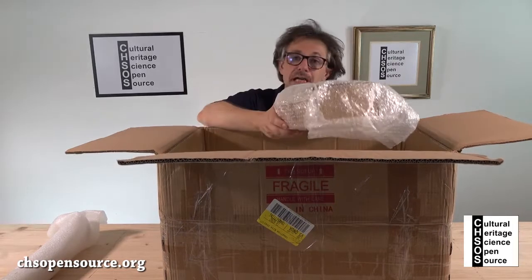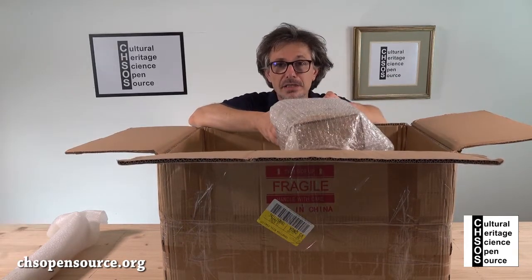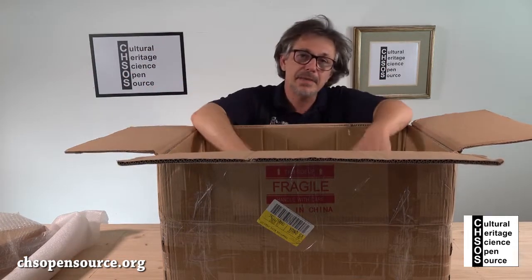This is the tripod adapter, for when you want to mount the Elvira spectrometer over a tripod. And the last piece on the bottom is the actual spectrometer.